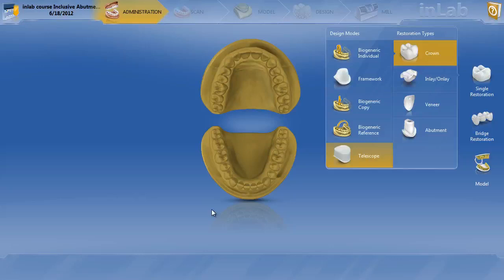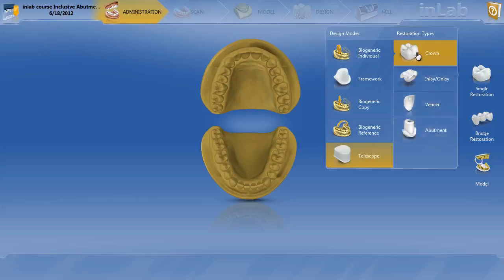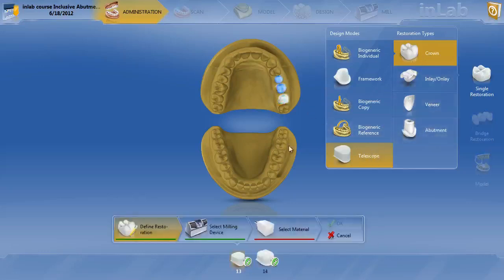So in this case, we're going to do tooth number 13 and tooth number 14. They're two 6 millimeter Glidewell tie bases, and we're going to make custom Emax abutments on them and actually parallel them so we can make an Emax bridge over the top, or two unit splinted restoration over the top. So how we're going to designate this, we're not doing abutments since we're not actually scanning the titanium bases. We're just going to call them Crown Telescope 13, 14. Our material is going to be Emax.